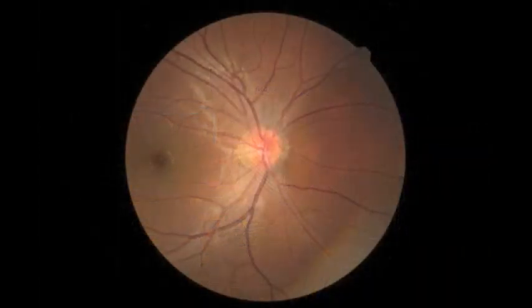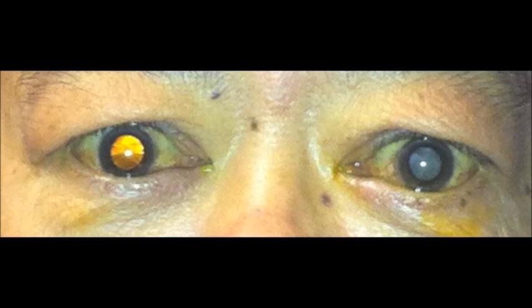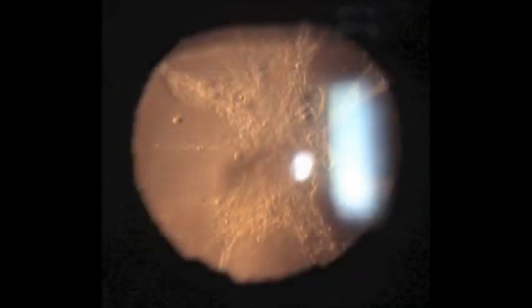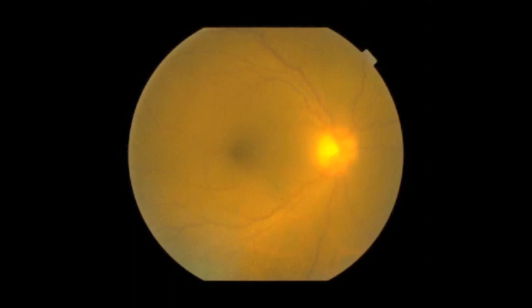However, opacities in the ocular media such as corneal scars, cataracts or vitreous hemorrhages can degrade the quality of the image, thus making it difficult to make a diagnosis.